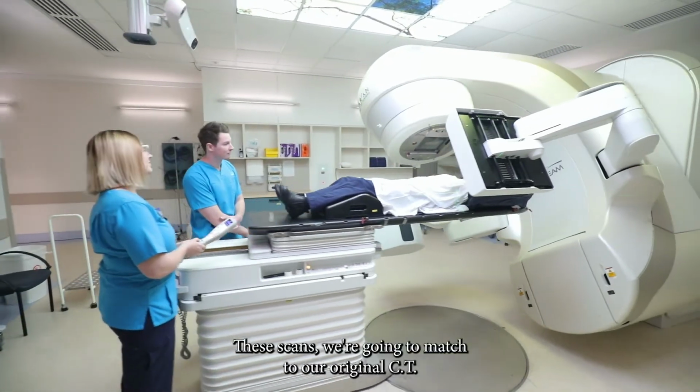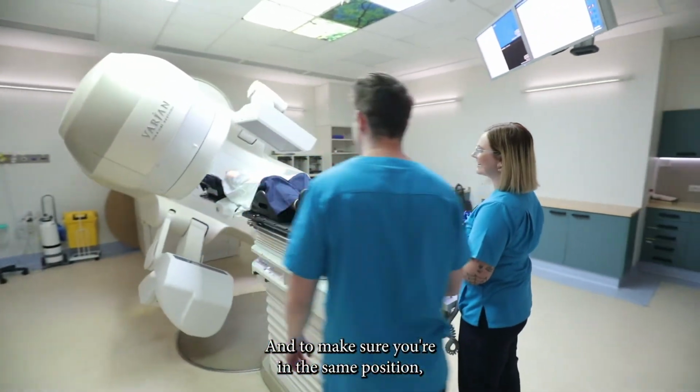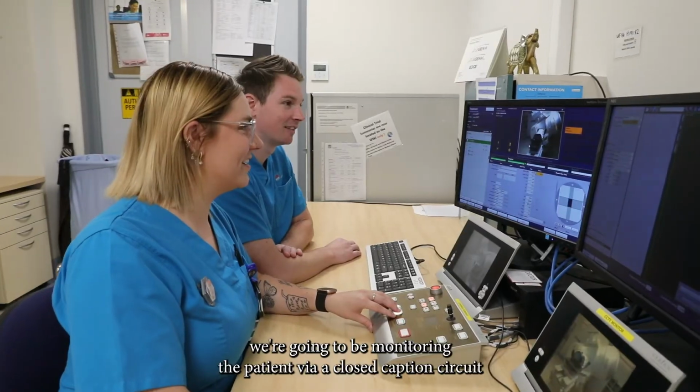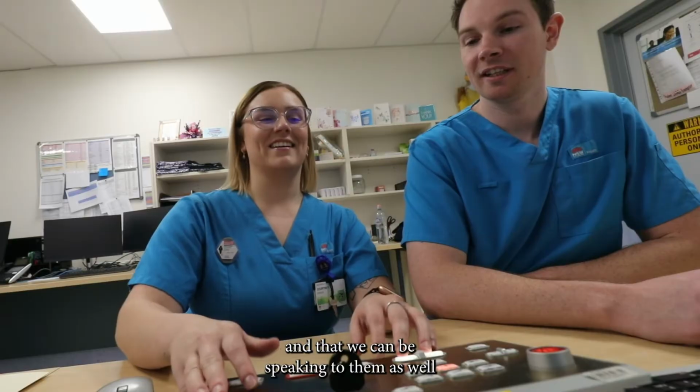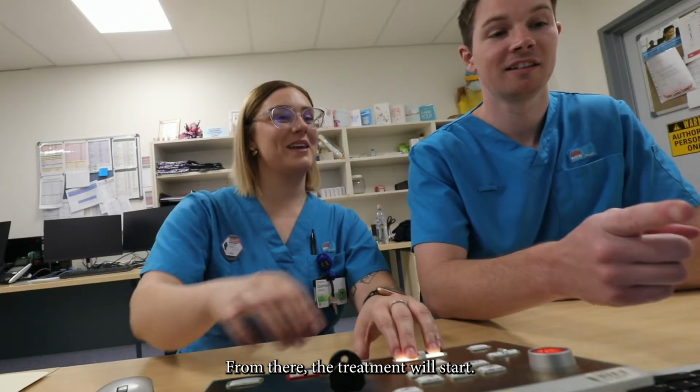These scans we're going to match to the original CT that the patients took with us, to make sure you're in the same position. We're going to be monitoring the patient via a closed-circuit camera and we can be speaking to them as well through some microphones that are kept in the room. From there, the treatment will start.